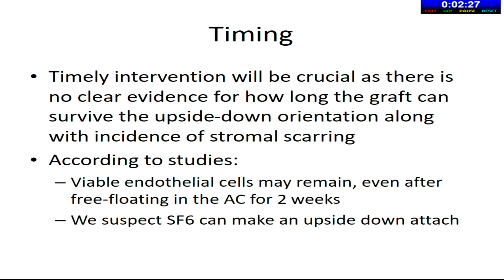So timing. Timely intervention will be crucial, as there is no evidence as to how long the graft can survive in the upside-down orientation, along with the incidence of stromal scarring. According to studies, viable endothelial cells may remain even after free-floating in the anterior chamber for 2 weeks. However, I would give you a caution that if you rebubble or tamponade with SF6, you can actually make the graft stick upside down, in which case the cells may be heavily damaged. And if you had done that, then maybe it's better to do a repeat DMEK graft.